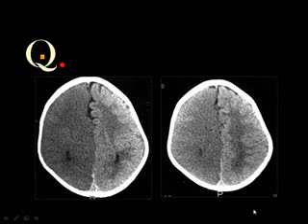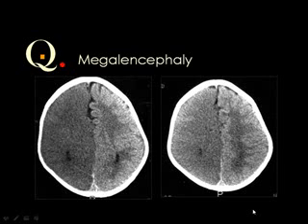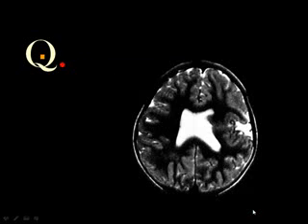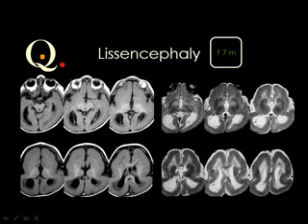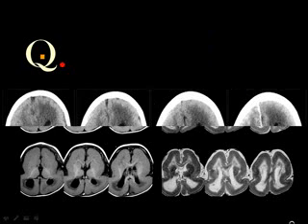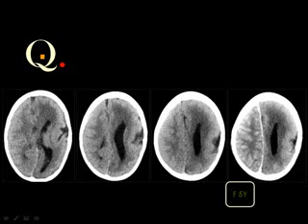Quiz review of cases: subependymal heterotopia, hemimegalencephaly on the right side, closed lip schizencephaly on the left side — note the diverticulum of the ventricle — lissencephaly, and hemimegalencephaly of the left cerebral hemisphere.